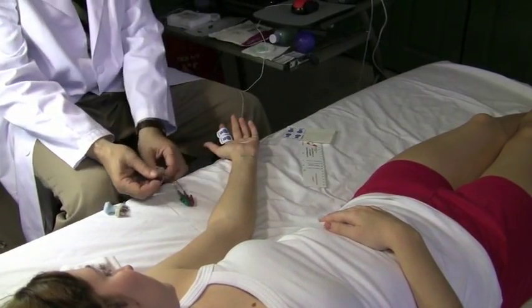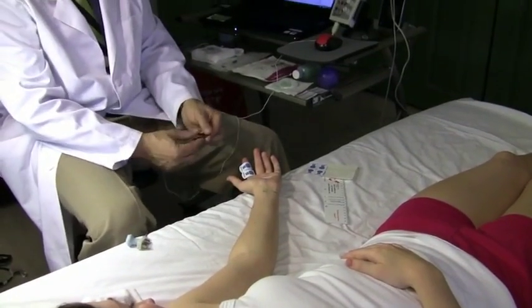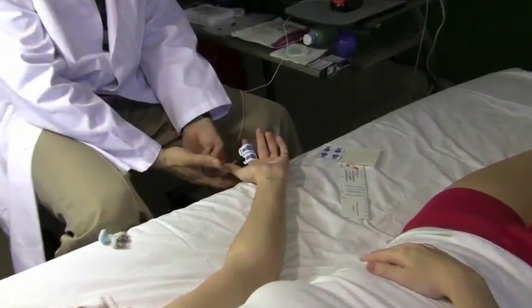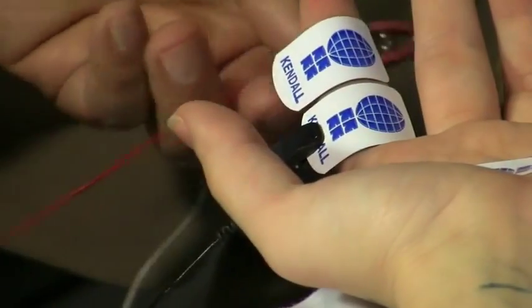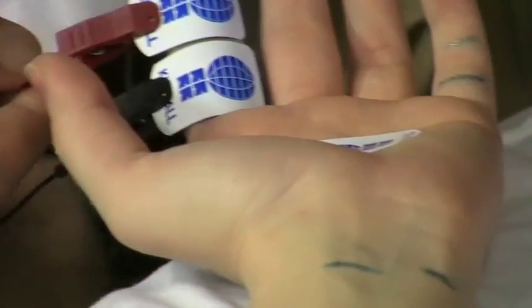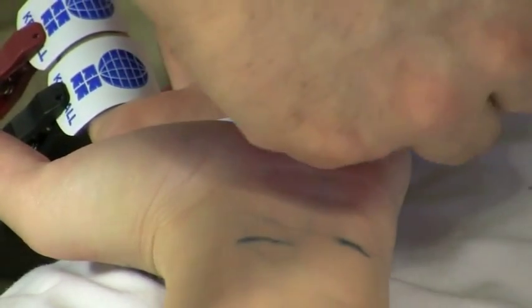How do I know which one is active, which one is reference? By plugging the black into the active, by clipping the red into the reference, and by clipping the green into the ground.